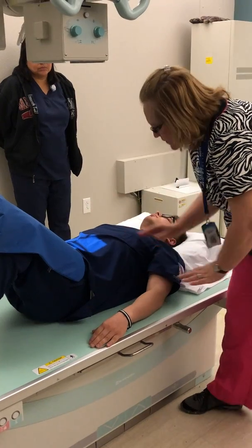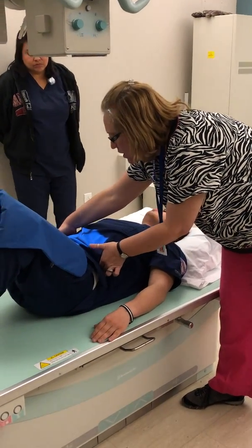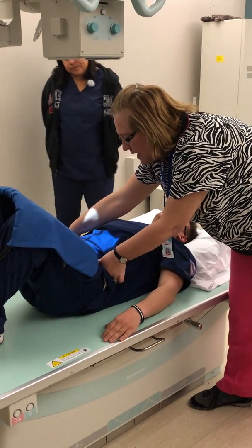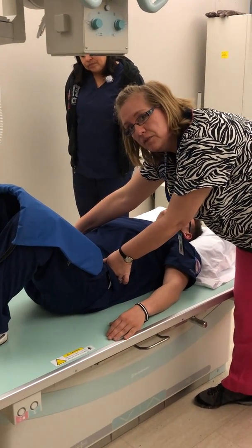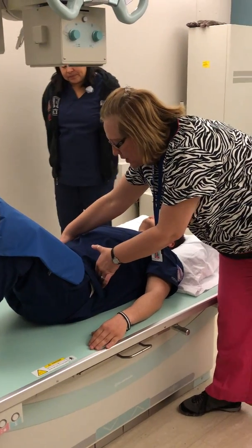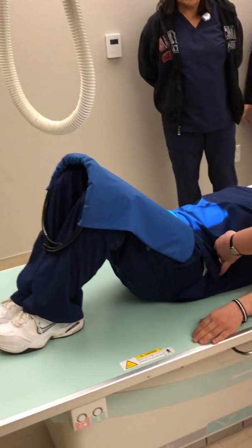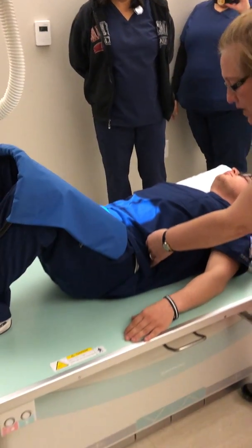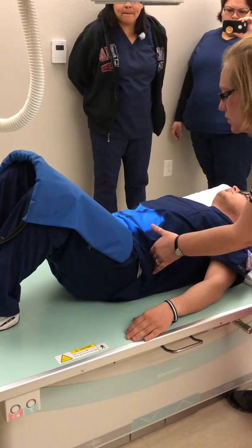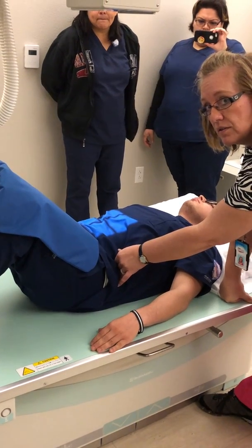I'm going to feel for the tops of your hips, and I feel with both hands so that I know that we're centered here. I'm also going to feel the ASIS, and that's my collimated field guide. Okay, so I want to collimate out to the ASIS. At the top of the crest here, I leave one hand in place when I do the measurement. If I'm doing lumbosacral, I can leave it at the level of the crest. If I'm doing lumbar only, I move up to 1.5 inches above the top of the crest.